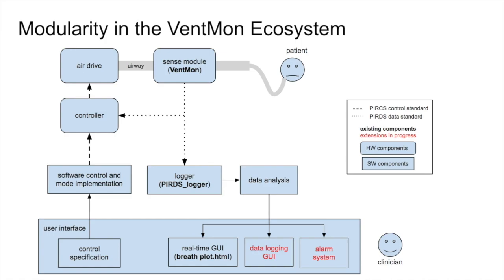Our goal here was to break down a standard ventilator into smaller, more modular components so that an open source maker-based team can focus on individual components and tackle the problems surrounding each of those in a smaller, more efficient way, as opposed to tackling the whole challenge of building a ventilator at once. This also allows teams to collaborate. One team can focus on one aspect of the ventilator while another focuses on a different piece. Then, in tandem, we can ultimately create better tested, more satisfactory devices.